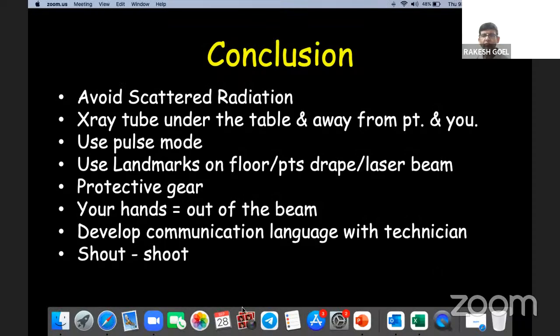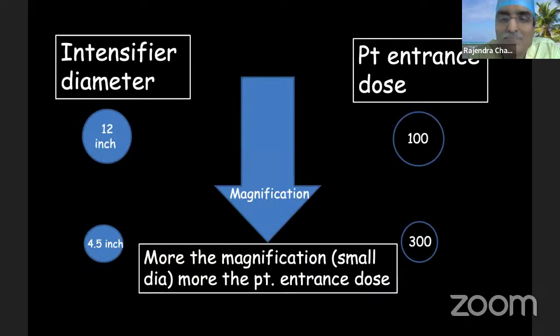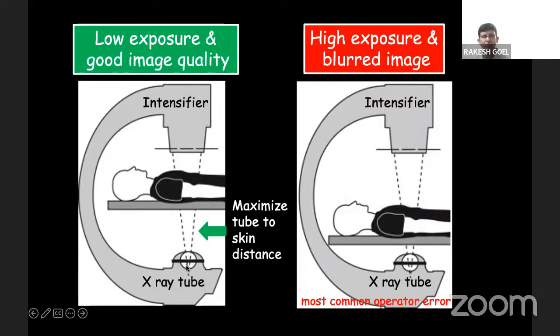Thanks, Sangeet. Any questions to Sangeet? Sangeet, which side of the screen to stand? Can you go back to that slide? X-ray beam side. No, but as per my knowledge, that is not the case. Sir is telling the opposite. Huh? No. See, same, sir. So this is the X-ray tube.